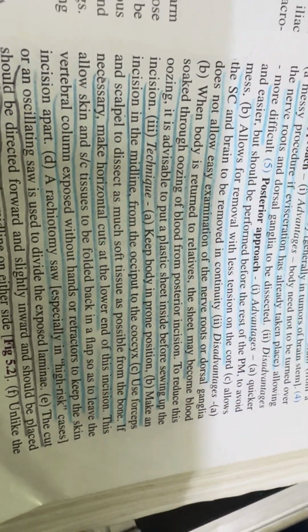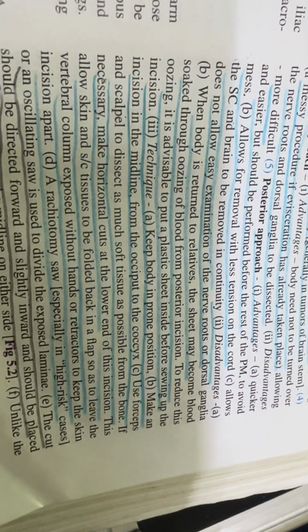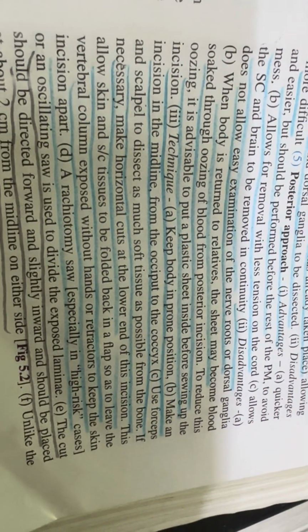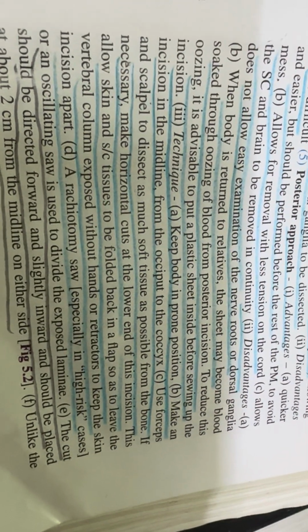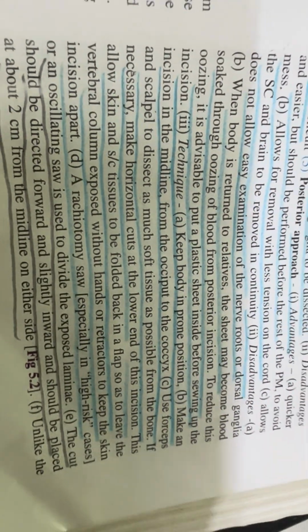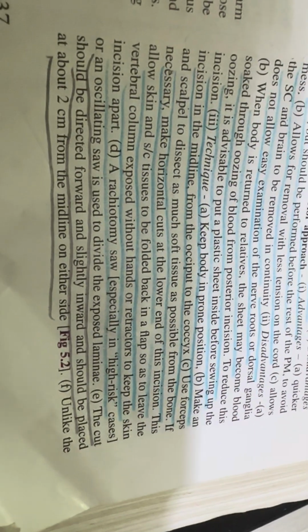Use forceps and scalpel to dissect as much soft tissue as possible from the bone. If necessary, make a horizontal cut at the lower end of the incision. This allows the subcutaneous tissue to be folded back in a flap so as to leave the vertebral column exposed without hands or retractors to keep the skin incision apart.